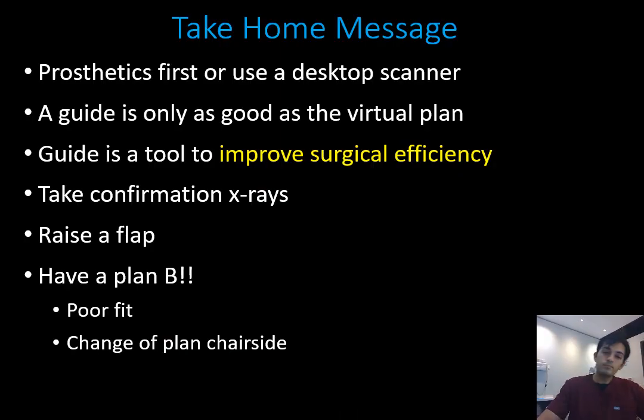So my take-home message would be, firstly, if you're going to use an intraoral scanner, start with prosthetics first, master the art of scanning before you use that scan data for the purpose of planning a case, or use a desktop scanner. Either way, make sure you get good scan data for use with your case.